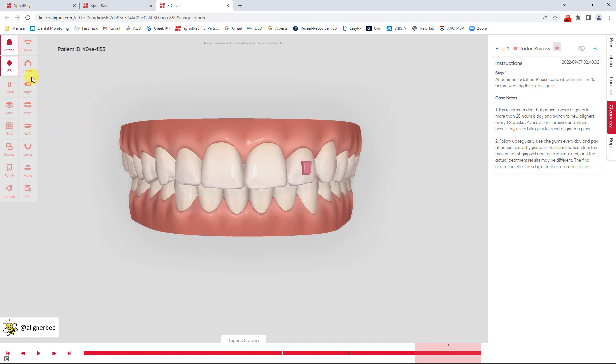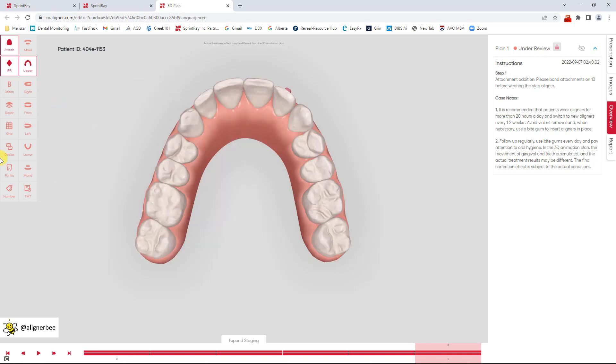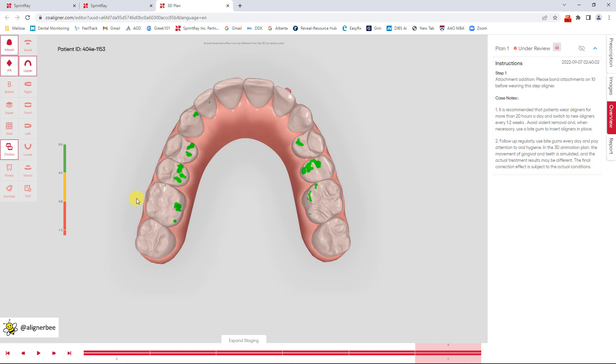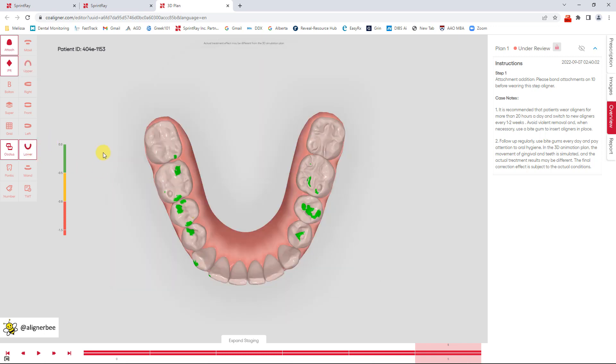But what I also really like is if I look at the arches and if I select occlusion, it's going to show me the patient's occlusion. So here I can see the final occlusion at this step. For myself, I like to have those heavier contacts in the posterior and lighter contacts in the anterior and I can always double-check to make sure that I am achieving that for my patient. Not just by simply looking at the final occlusion in the models but by actually looking at the heat map where it's detected that they will be contacting and touching.